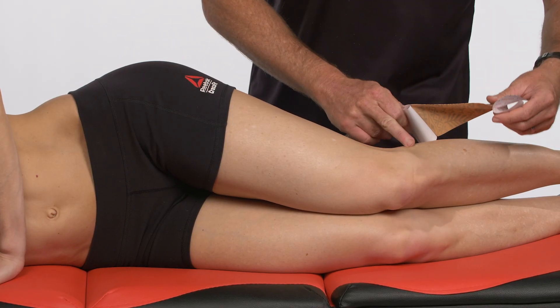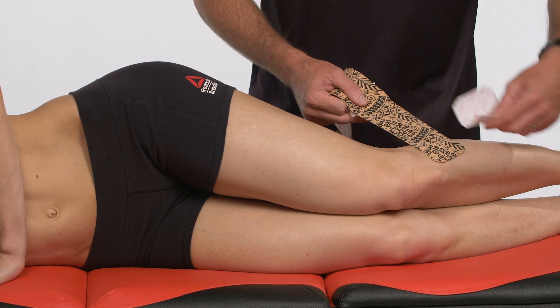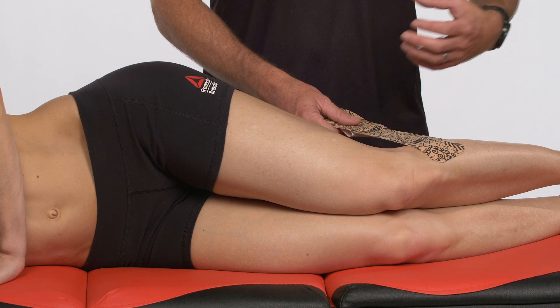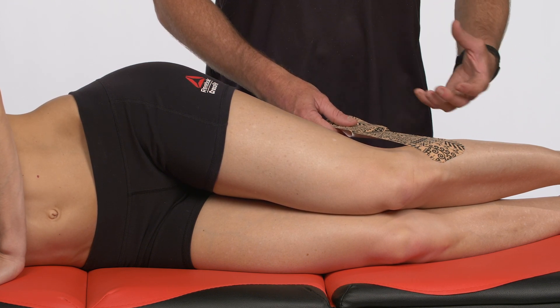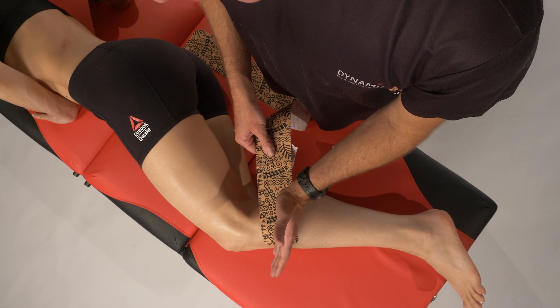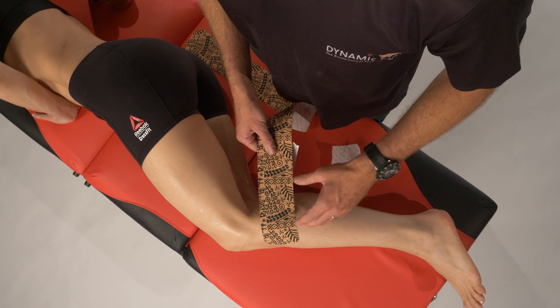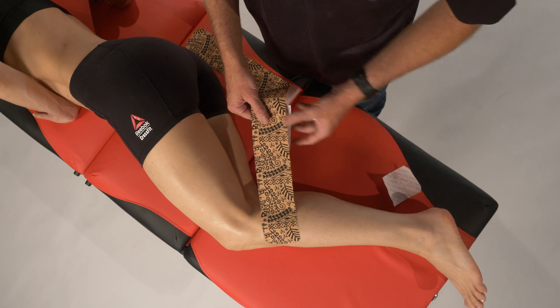We're going to start over that head of the fibula. It's important to be careful of the common peroneal nerve and that we're not creating compression. We need to warn people if they're getting pins and needles or numbness that they need to remove it — it may be too tight. If you really hook underneath the fibula head, you're more likely to cause that compression directly on the nerve, so coming right over the top of everything makes that less likely.